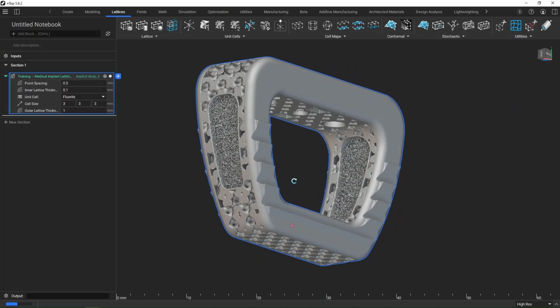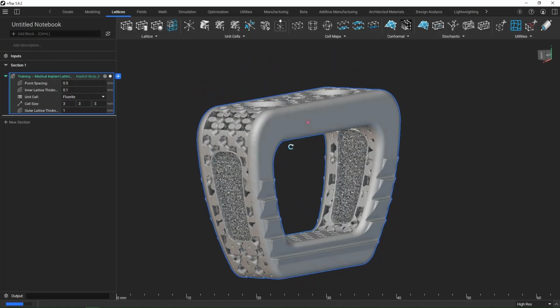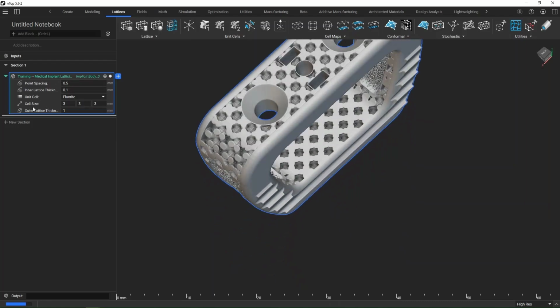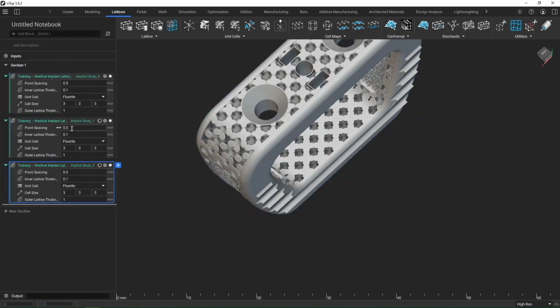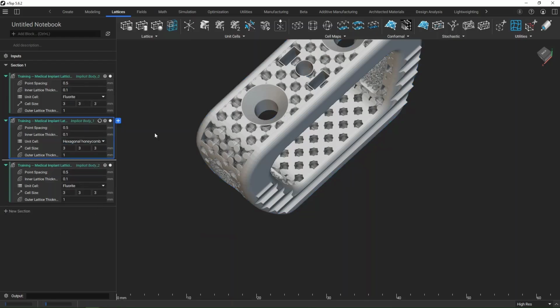This is a bit crazy, right? We've got quite a contrast between that outer lattice and that inner lattice, but this is really why we want to be able to test that, play around with things. We could go ahead and actually create a whole bunch of these and be able to very quickly iterate, try different things. Maybe we want to use that hexagonal honeycomb instead, something more face-based. We can open this up. Maybe make this a little bit smaller as well. But really a lot that we can play around with.